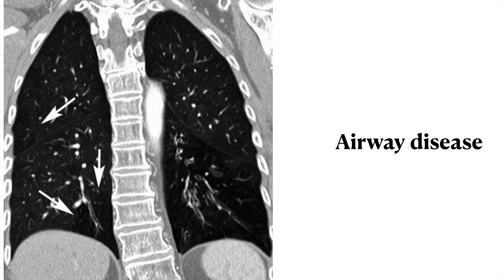Coming first to hypoperfusion and mosaic perfusion. This can be because of mostly two reasons: either it can be due to the airway, where the small airways have been damaged resulting in reflex vasoconstriction, or it can be vascular, where the vessels as such are having a problem. This particular CT scan is showing decreased attenuation — almost the whole of the left lower lobe is having decreased attenuation, and we have some mosaic attenuation in the right side in both the upper and lower lobes.